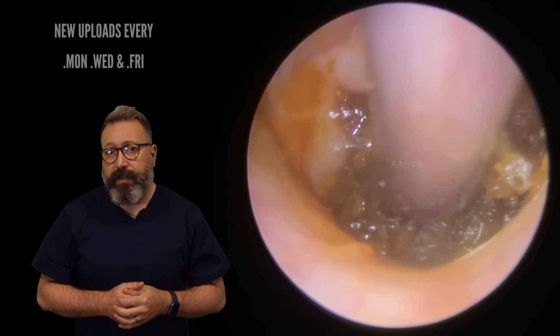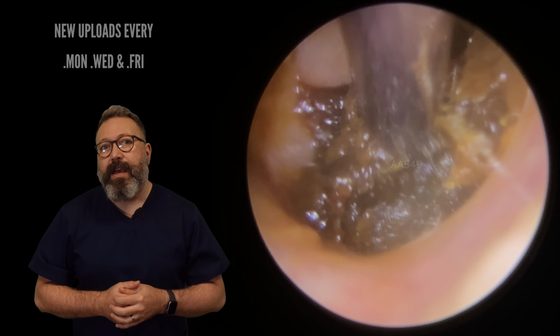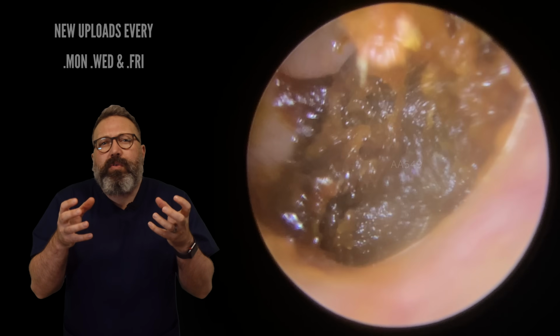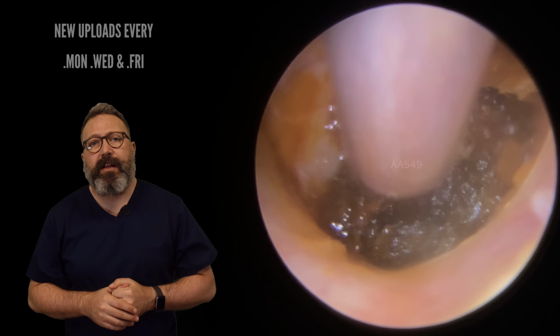So we're just going to lift. There we go. You can see how it's starting to come away really nicely, and this sort of ribbon, this layer of skin that's running through this is almost kind of holding it together. You can see I'm pulling it here, and it's gone from the bottom straight up through the middle and into the top section there. So we're just pulling that away.